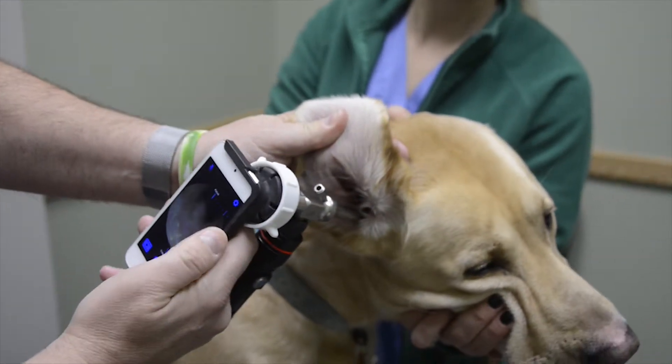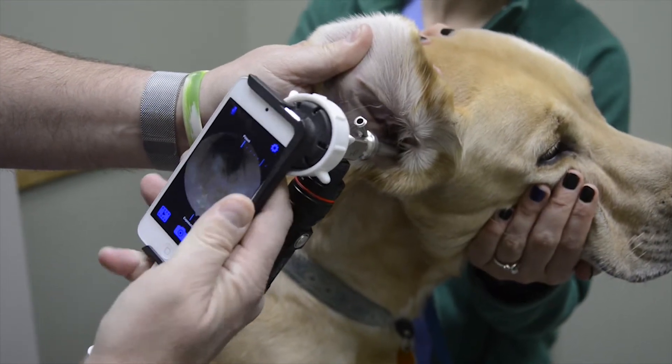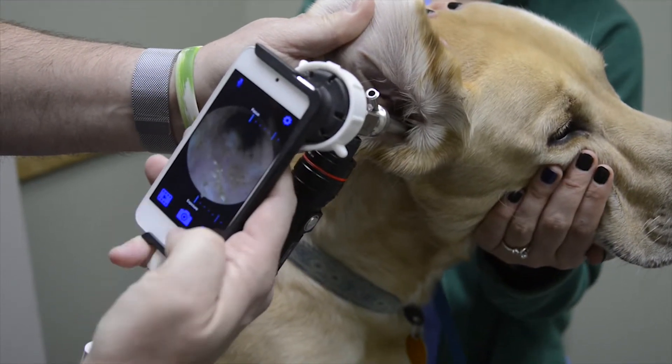To focus the image, touch the screen in the middle of the screen. Tap the camera to take a picture, tap video to take video. Images are stored under the film icon.